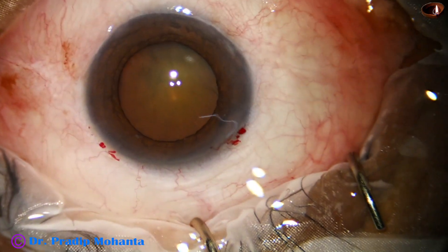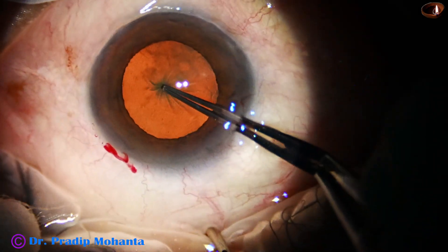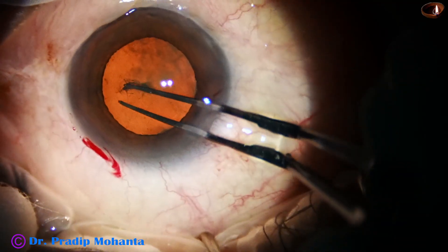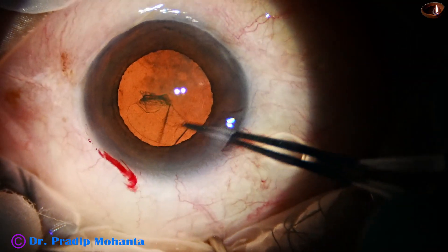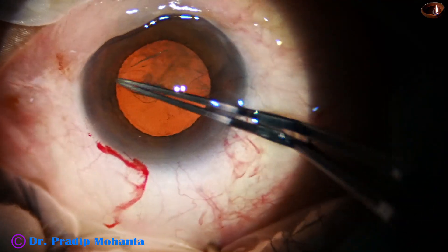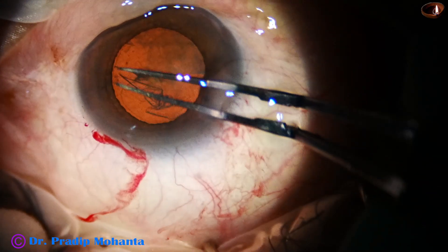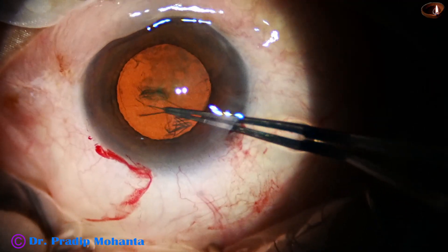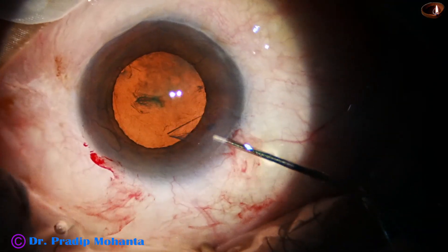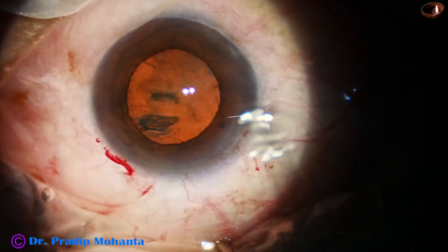This is a side port on the left side of the main incision, about 3 o'clock hours away. Now, with stereo coaxial illumination, I am trying to do capsulorhexis. You could see some folds and wrinkling of the anterior capsule, which indicates that the zonule is a bit weak, so we have to be more careful. Capsulorhexis has been done, and the capsular tag has been guided along the margin of the pupil to get an adequate size structure.